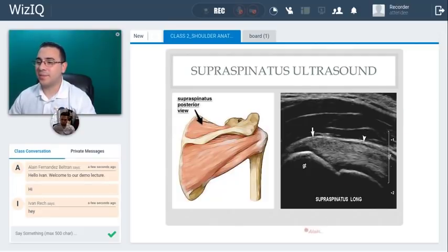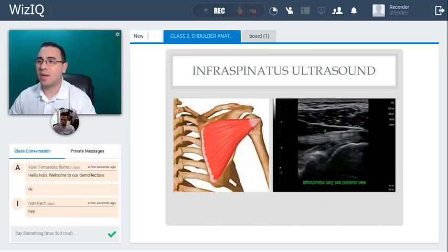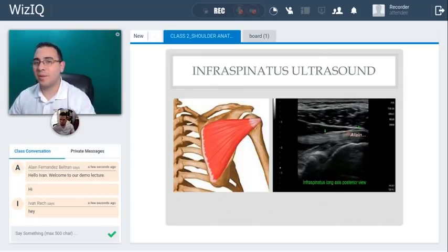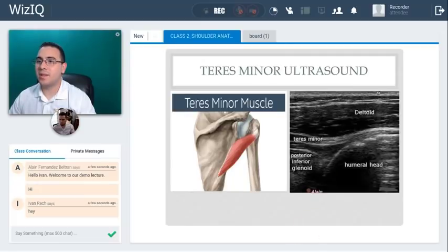This is the infraspinatus — also in the posterior approach — and this is what it looks like in ultrasound. Remember its function is external rotation. This is the ultrasound appearance of the tendon. And here is the teres minor with the humeral head next to it.